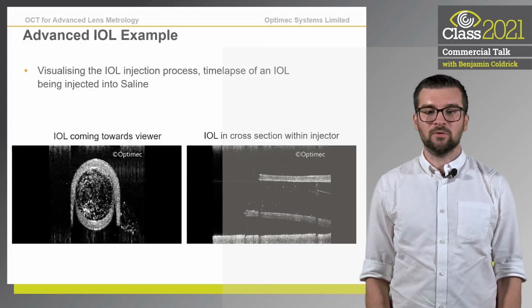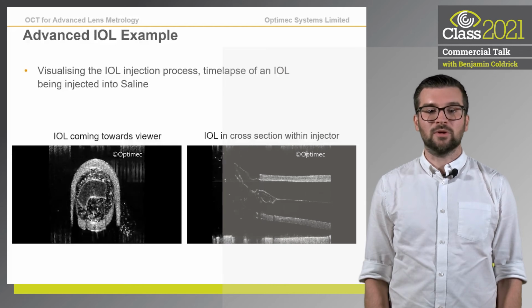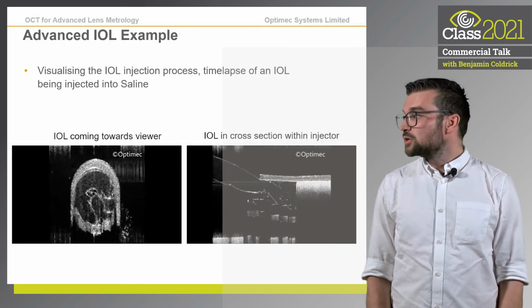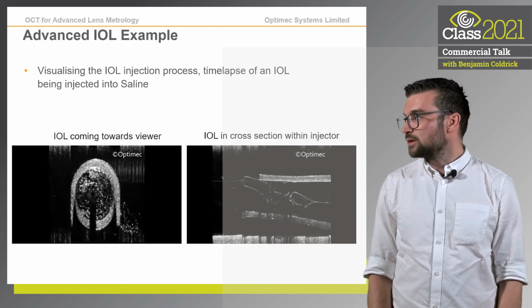Here is another example where we can see two videos showing how an IOL passes through an IOL injector, visualizing both the rolled IOL and how it is pushed out of the injector into fluid.